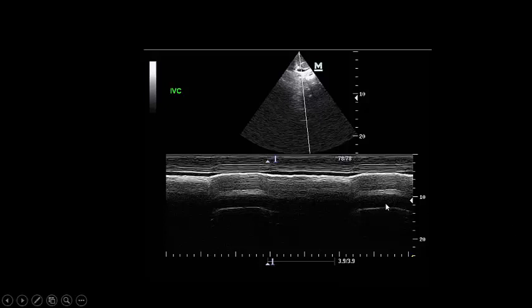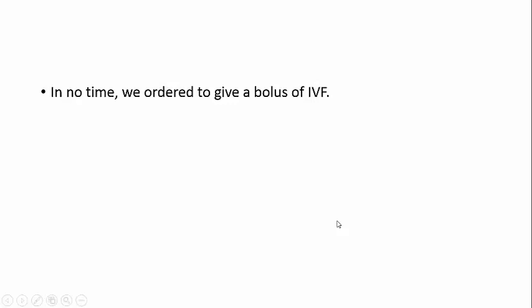We started critical care ultrasound. First, the inferior vena cava — very narrow, totally collapsing. So immediately we ordered a bolus of IV fluids; we asked the bedside nurse to give 500cc of saline while I continued examining the patient.